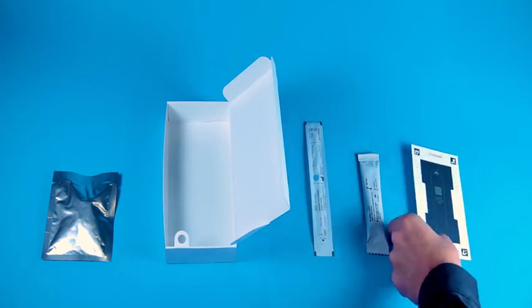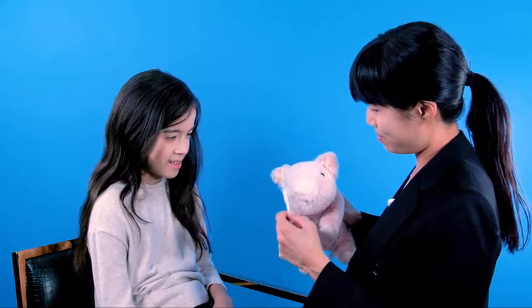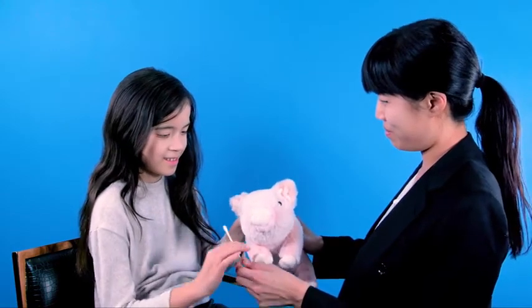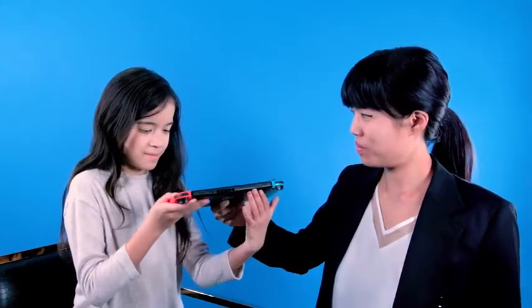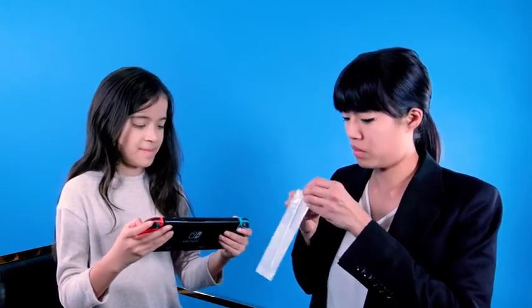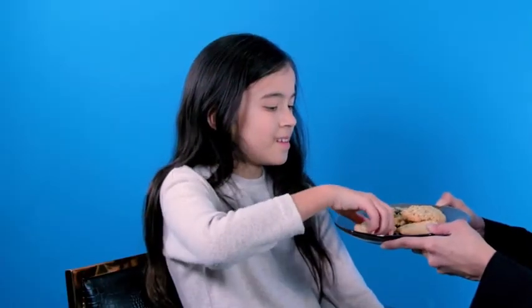We recommend the following techniques. Have all test supplies ready prior to collection. Have a caregiver demonstrate pain-free collection on a stuffed animal using a household Q-tip. Use an iPad or iPhone to play music, a video game, or a movie to distract the child prior to collection. Offer a reward to encourage cooperation.